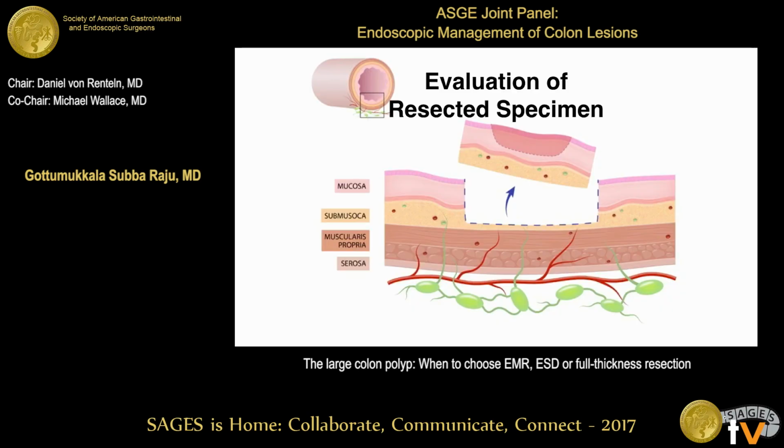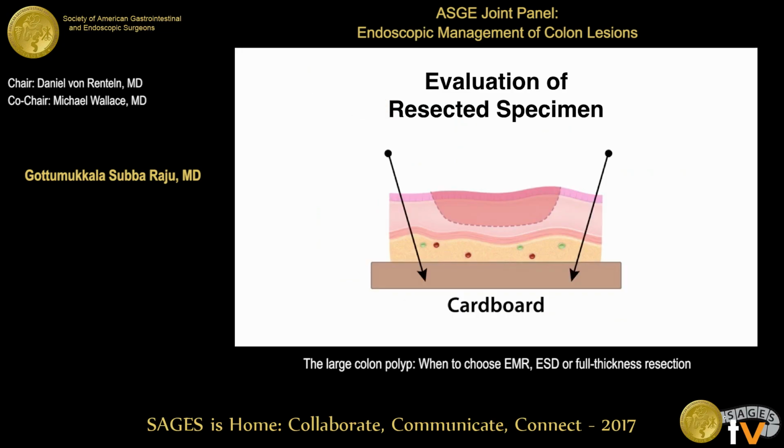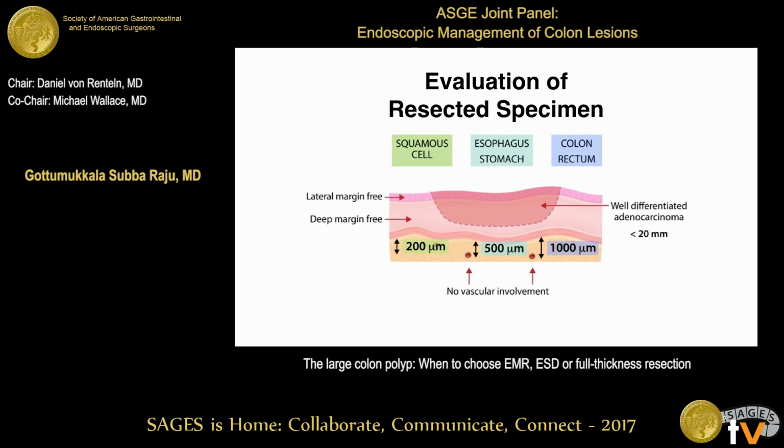So one other thing to keep in mind is, as endoscopists in this country, we try to throw the specimen into the formalin jar. But we should take some time to pin the specimen to the cardboard. That would help the pathologist to look at the details and give you a comprehensive report.